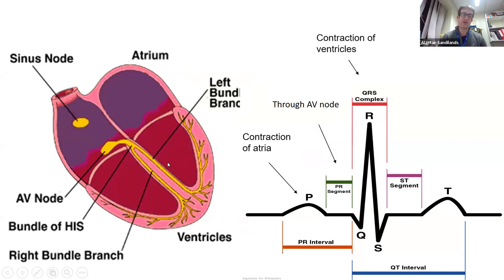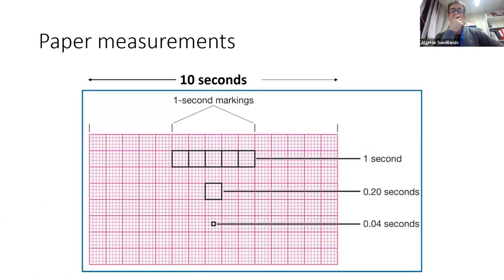Next, when we're talking about the contraction of the ventricles, we have depolarization beyond the AV node, down the right bundle, and down the left bundle. And this will generate our QRS signal. And then at the same time as the depolarization has started, there will be repolarization behind it that will start after the Q and will finish repolarization at the end of the T wave. So we know how our signals are generated now in a simplified fashion.